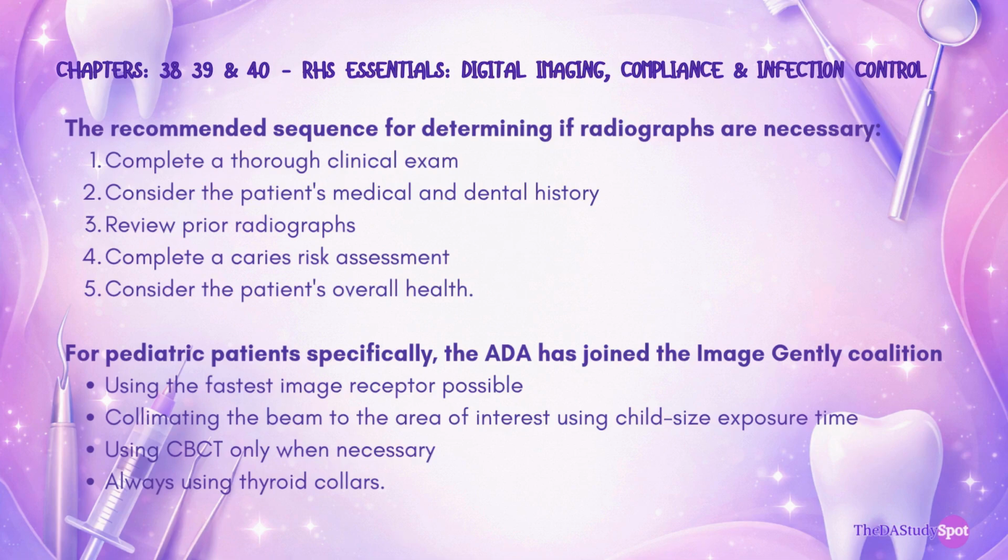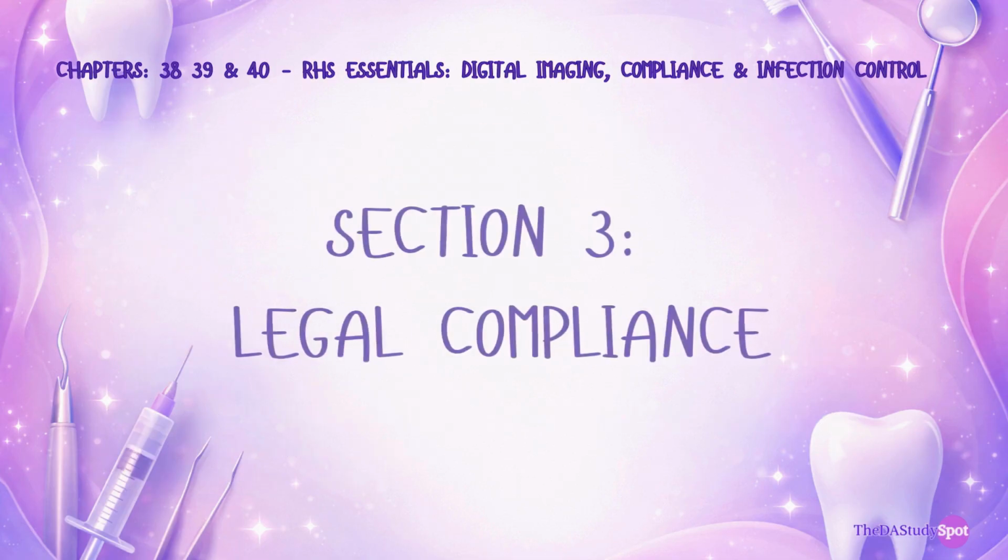sure we're using the fastest image receptor possible, collimating the beam to the area of interest using child size exposure time, using CBCT only when necessary, and always using thyroid collars.